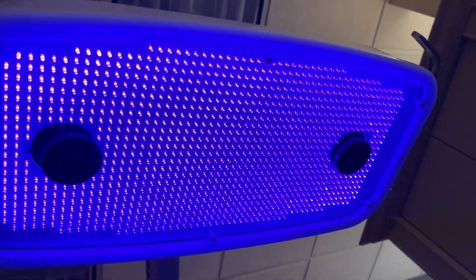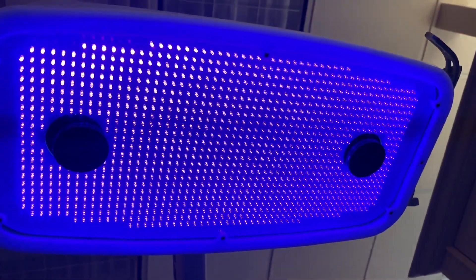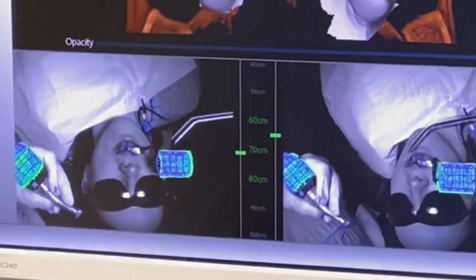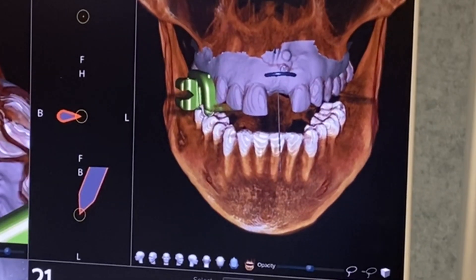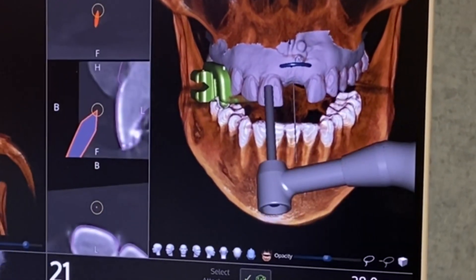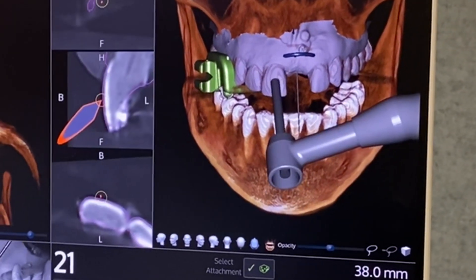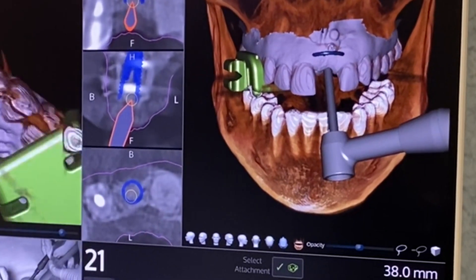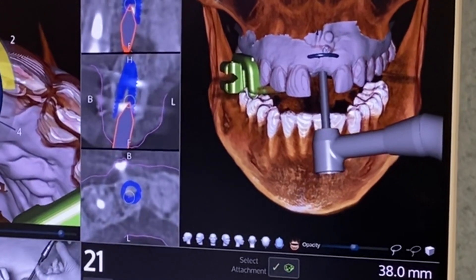When we look up, there's the two cameras. They have a kind of fluorescent light to help see the trackers. This goes over top of the patient, and you have to keep the trackers in view. As we go in, you'll see my hand moving around — it's kind of cool. You can see the cylinder, which represents the drill, and we're testing and calibrating the system now.